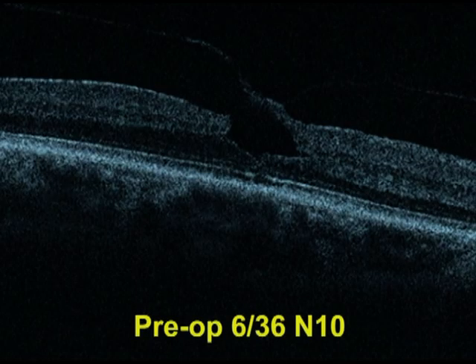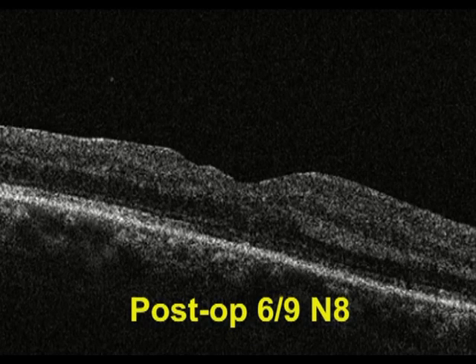In this lamellar macular hole, pre-op best corrected visual acuity was 6/36 and N10, and post-op best corrected visual acuity was 6/9 and N8. So the colored visco suction-assisted ILM flap placement technique is easy and reproducible. Thank you.